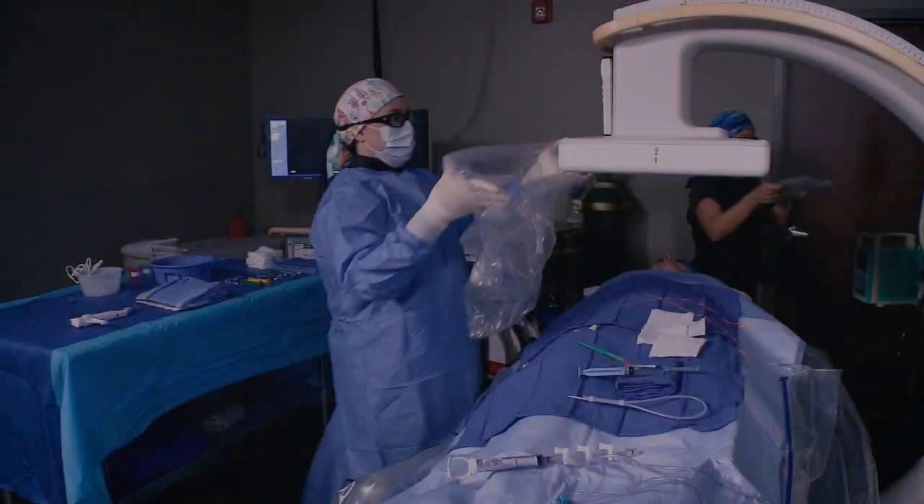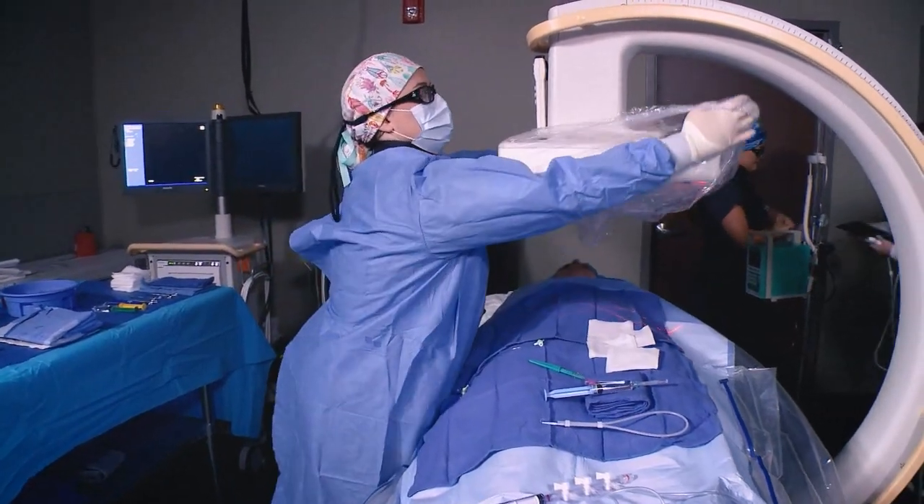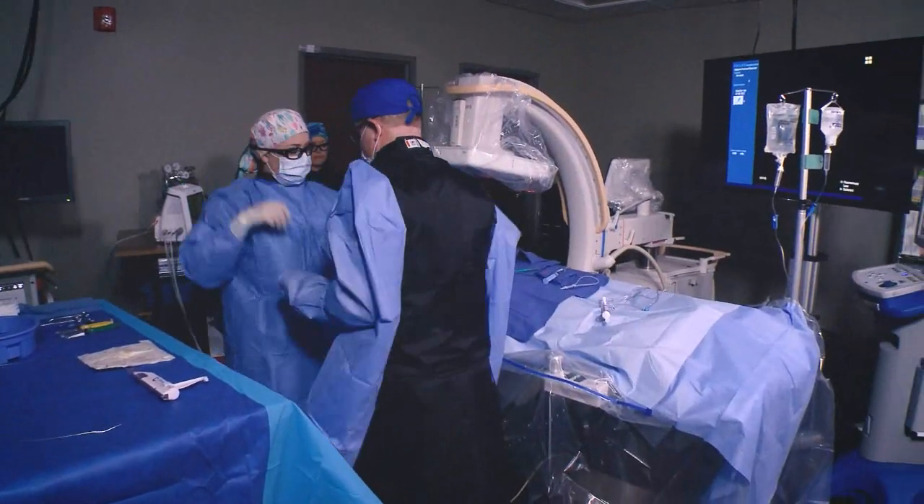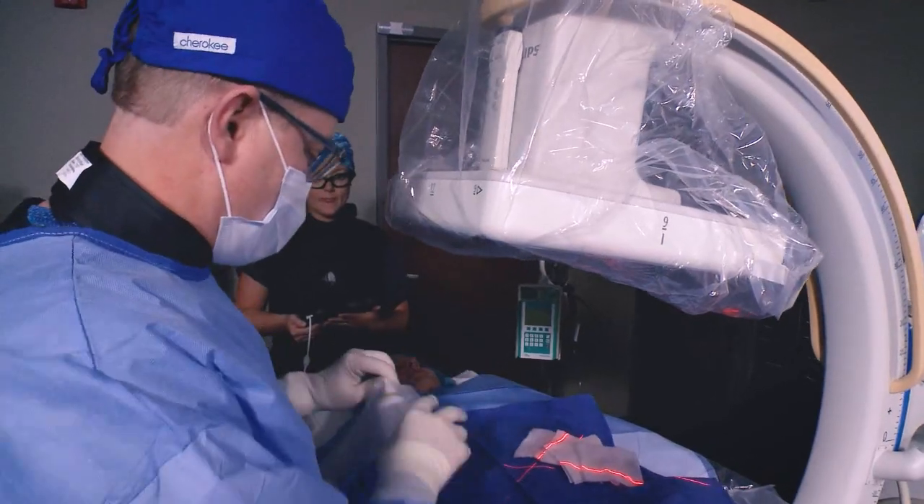Advances in minimally invasive surgery are fueling the growth of office-based outpatient procedures. The Philips Veradius Unity Mobile C-Arm with Flat Detector is the center of that experience.